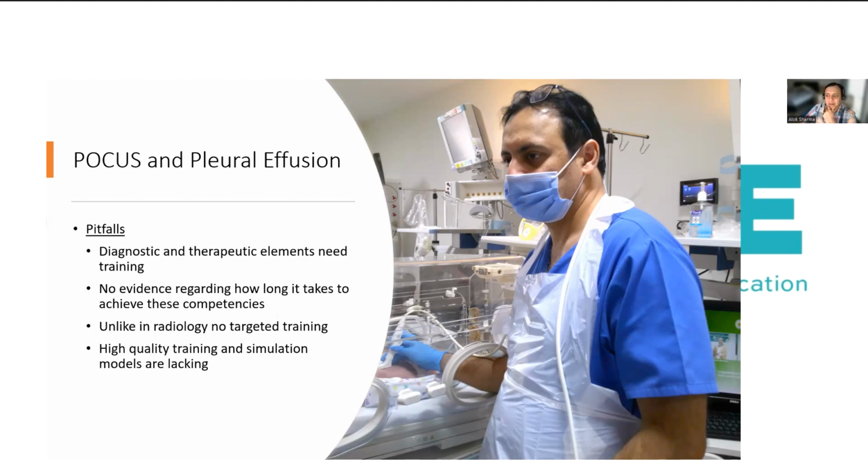For me, it's taken years to learn. But the diagnostic aspects of being able to diagnose lung conditions and pleural effusion are definitely evidenced. From the current group of 35 people we've been training, I'd say 25 of my colleagues are well on the way to achieving those competencies over a 3 to 6 month period.